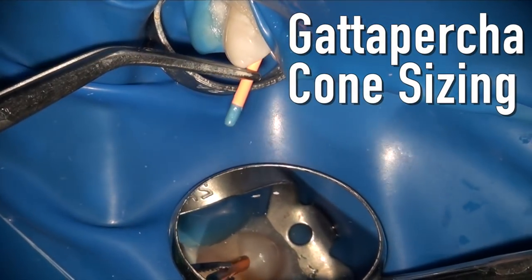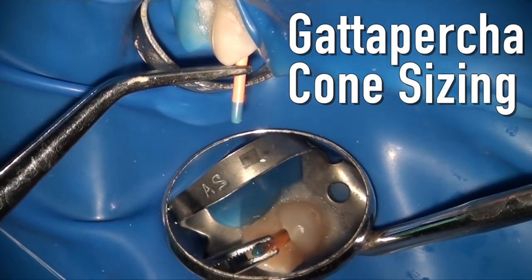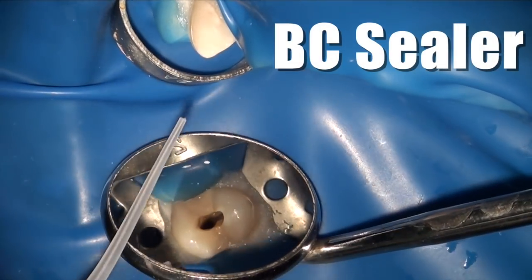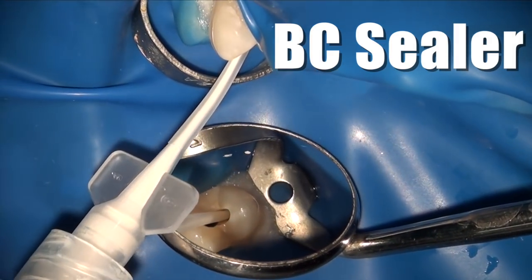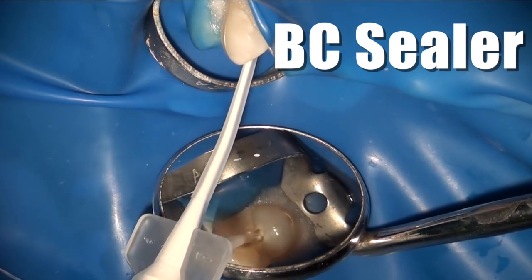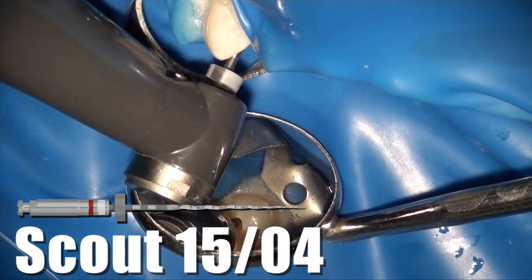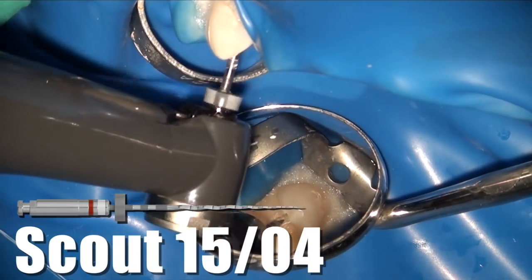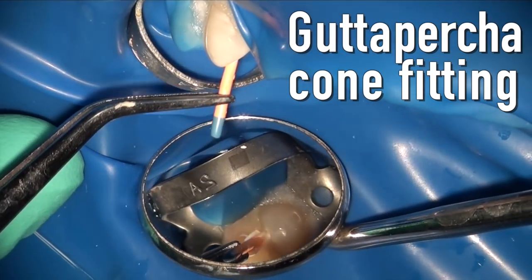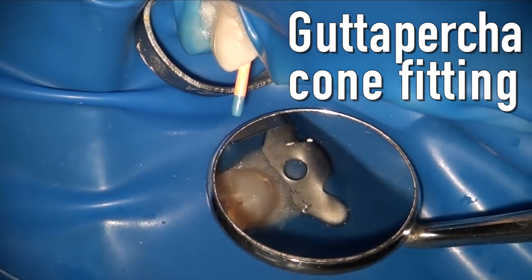I proceed to cone fit, and I prefer to cone fit one size smaller BC cones, because it took a number of strokes for the finishing file to get down, meaning it was a fairly tight canal for that shape. By having one size smaller cone fitted to the final finishing file, I allow room for the escape of BC sealer, which I inject with an advanced technique directly into the canal so that the cones can seat all the way down. I'm using my expediter — or you can use a 1504 — at reverse speed at about 100 RPM, which works almost like a lentulo, coating the canal walls and the fitted cones to make sure they're seated all the way down in both the buccal and lingual canals.